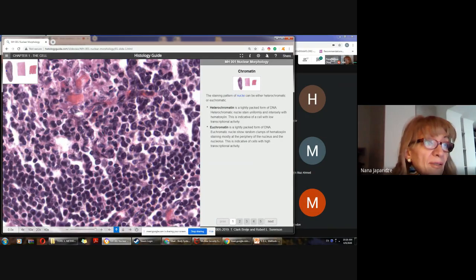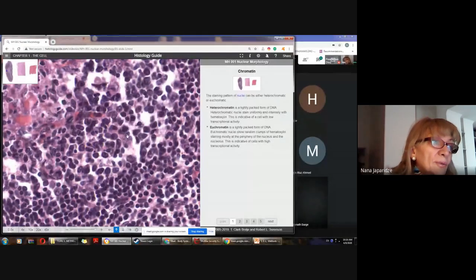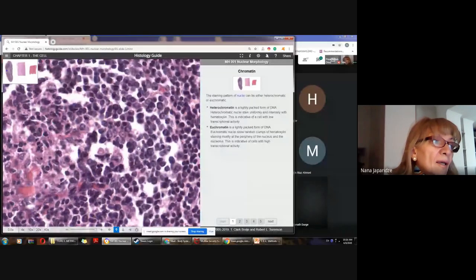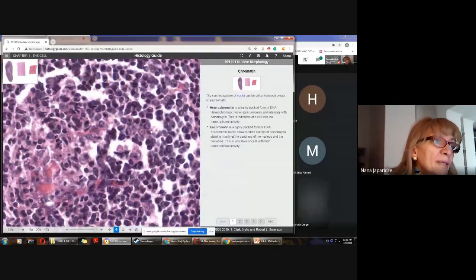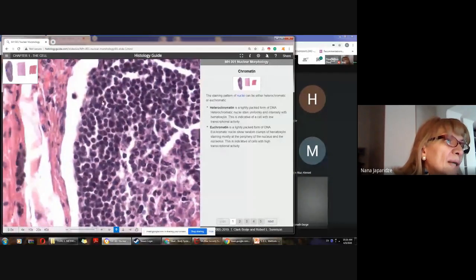Lymphocytes, look, lymphocytes. Plus we can see here also quite big cells, look, with a quite light stained nucleus. In these places, we are able to identify easier, for example, macrophages, connective tissue cells, or we can see here also fibroblasts.